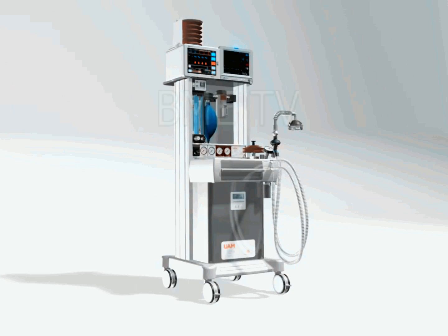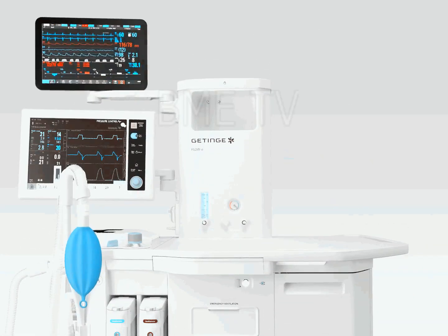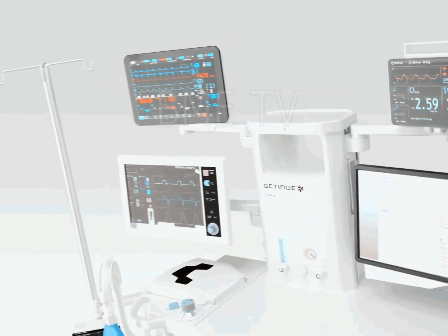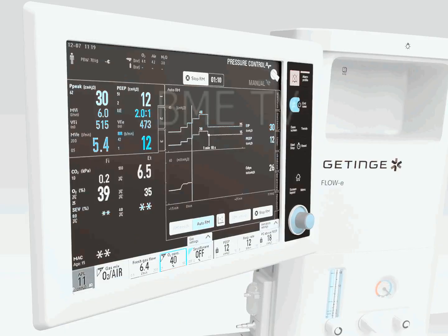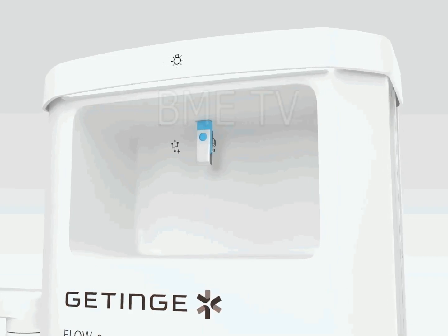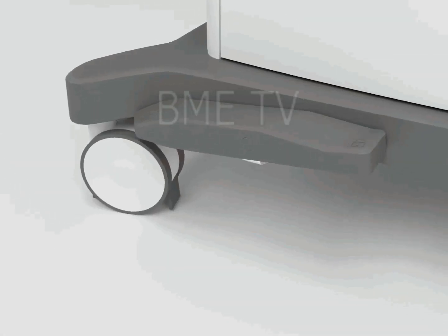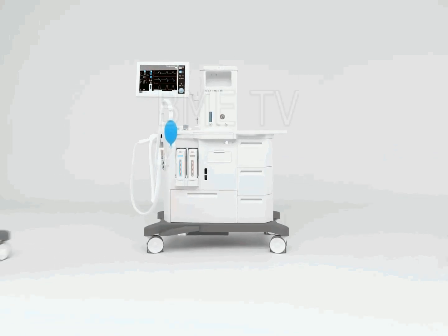Another important distinction is that scavenger interfaces may be open to the atmosphere, or closed, where gases within the interface communicate with the atmosphere only through valves, the older type. The different types of interface have clinical implications. Clearly, open interfaces are safer for the patient. From being relatively unknown 10 years ago, they are becoming almost universal on new equipment, so patient and anesthetist safety demands users' attention to the distinctions.